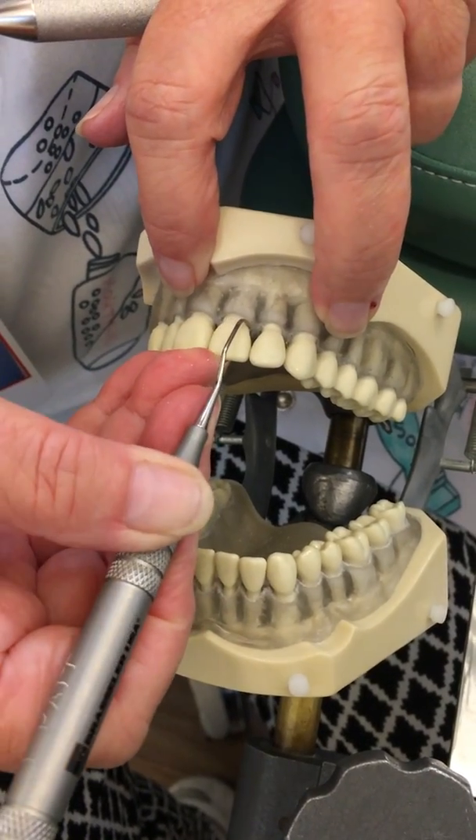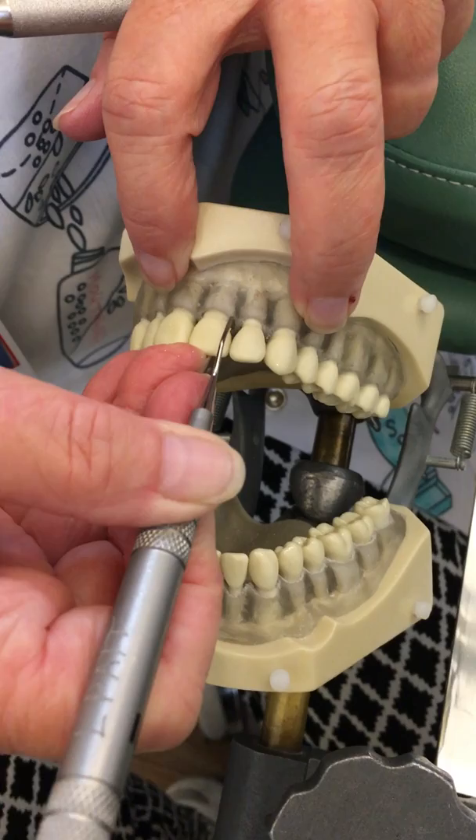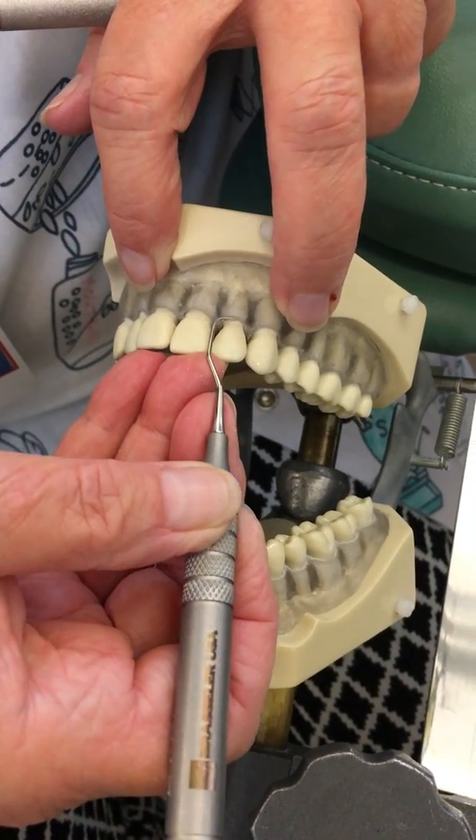I'm not wearing gloves so you can see what my hands and fingers are doing. We would be wearing gloves if this were a patient.